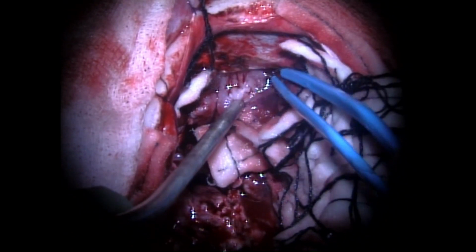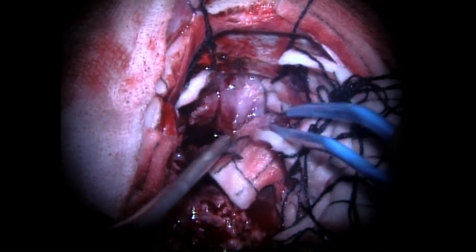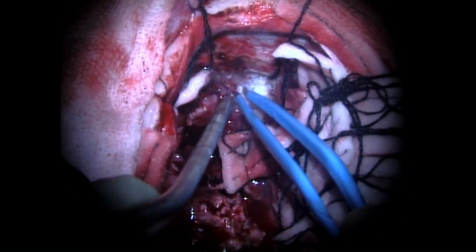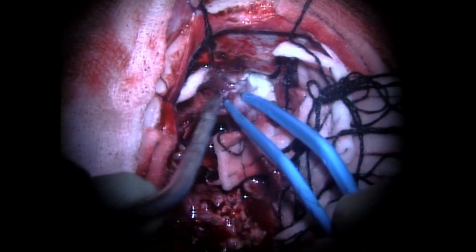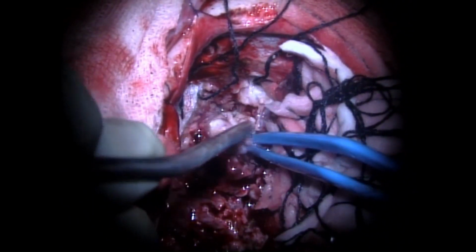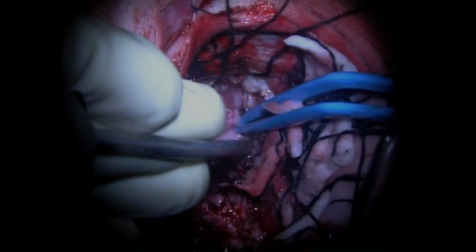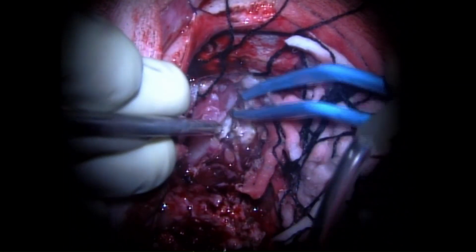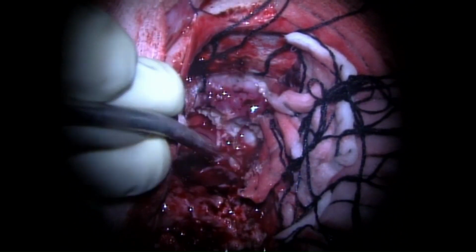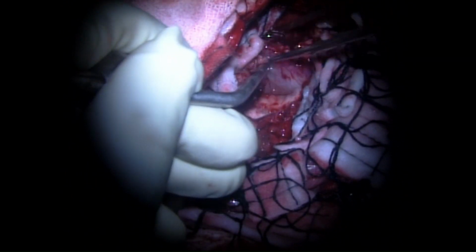Here you can see the tumor being delivered from underneath the falx cerebri by gently pulling it with the use of bipolar coagulation forceps and suction, sometimes with the use of tumor biopsy forceps. Most important was not to cause any damage to the normal brain parenchyma as well as the branches of the ACA in this region. And we resorted to rather removing this tumor piecemeal.